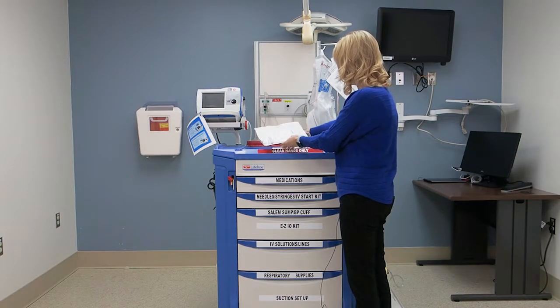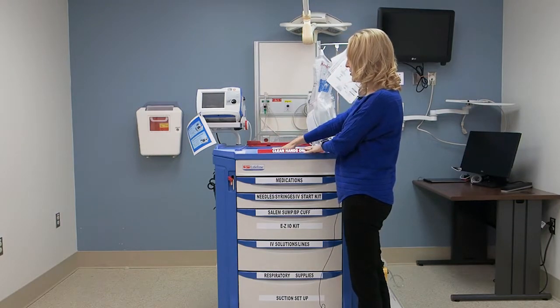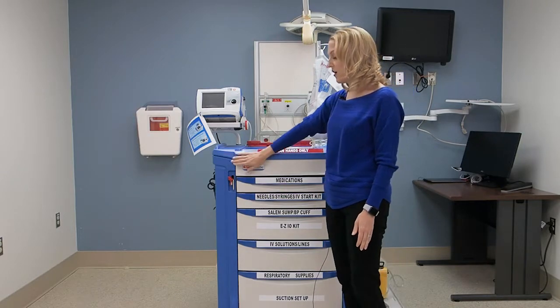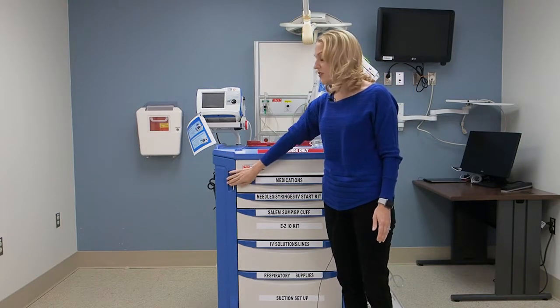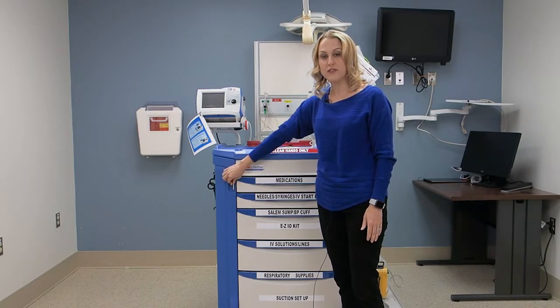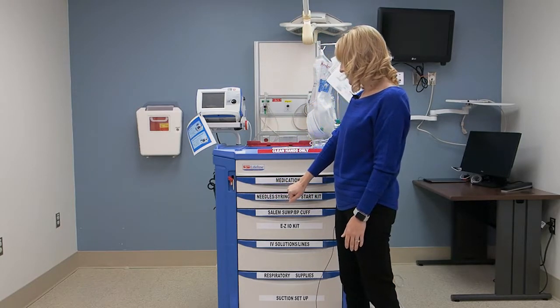That's there for you. And inside, we also have some gloves, a mask with a shield, and then a shave prep tray. Remember that our carts are going to be locked, and the cart that is going to be located on the floors is going to have a lock. You will have to pull that and unlock it so that you can use it.